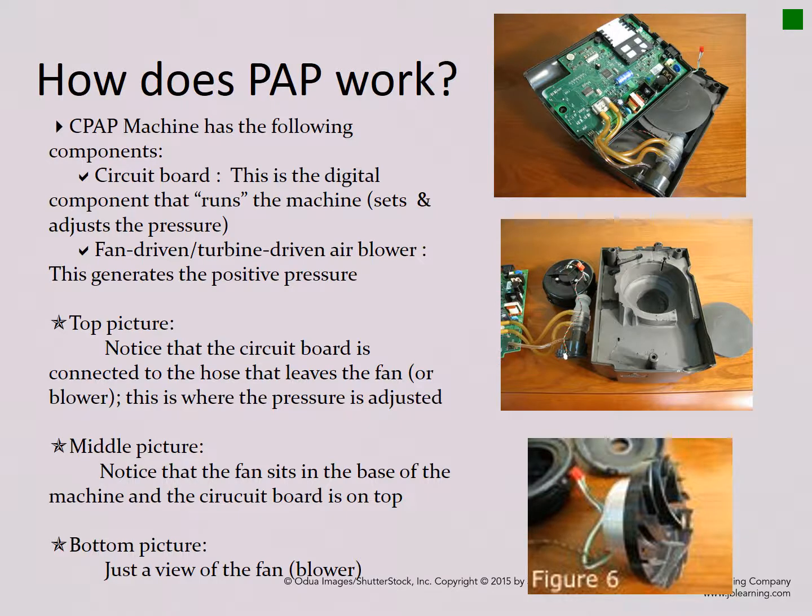The top picture, that's the circuit board. The next picture down, that's just the fan sitting in the base of the machine, and the bottom picture is what the blower looks like. That's it. There's no oxygen, nothing.